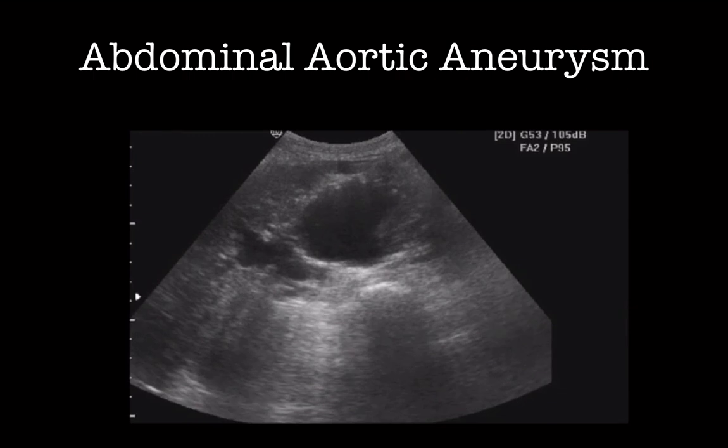I told you that you couldn't necessarily see the retroperitoneal blood. Here you can see the blood just outside of the aorta. This is a rare finding because when you see this much blood retroperitoneally, it's a fair amount of blood. And remember, as the amount of blood increases, the volume increases, the pressure increases. And as the pressure increases on that retroperitoneum, the peritoneum itself, then it's at risk of rupture also. And then you would have a free communication into the abdomen, and then you would only have seconds to live.